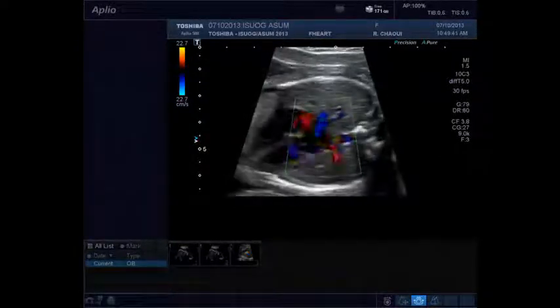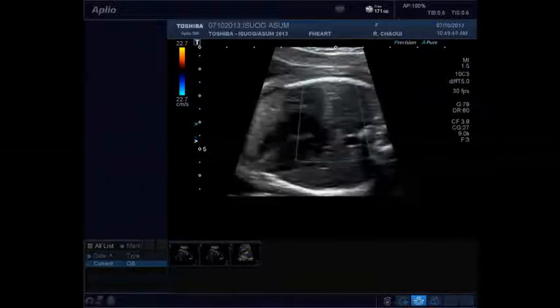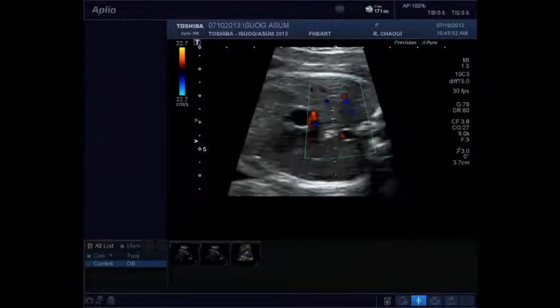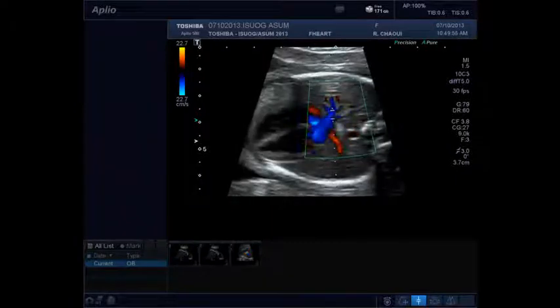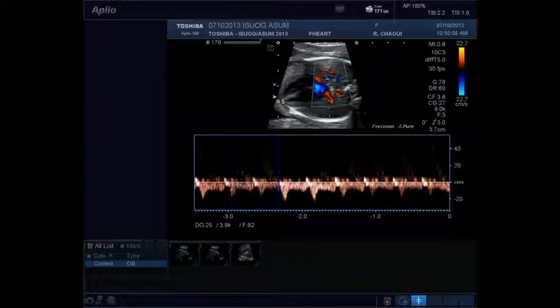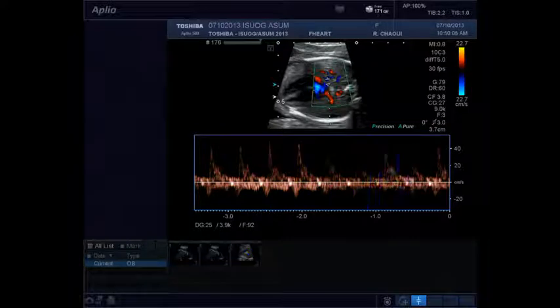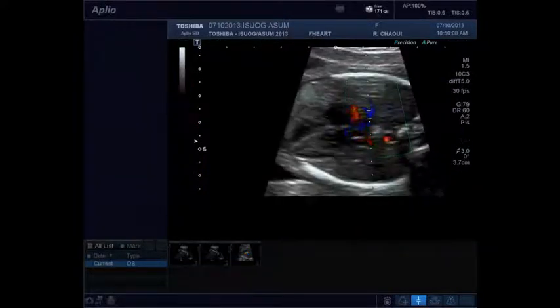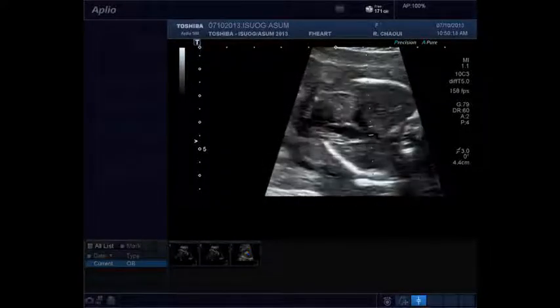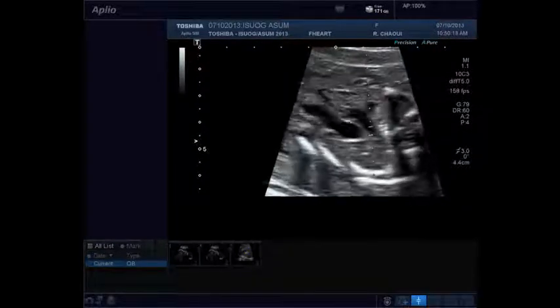The other question where it can make sense is to sample the pulmonary veins, because especially in left obstructive diseases and in abnormal lung vein connection, it can be helpful. But at this stage, you see the normal flow. At this stage, if you are able to see the whole details and to sample them, you are already, let's say, performing very high-level fetal echocardiography. In other words, rather no. We do it, for example, routinely for ductus arteriosus when we were having indomethacin therapy on the ward and these things. But in general, this is a targeted question, not on a routine scale.